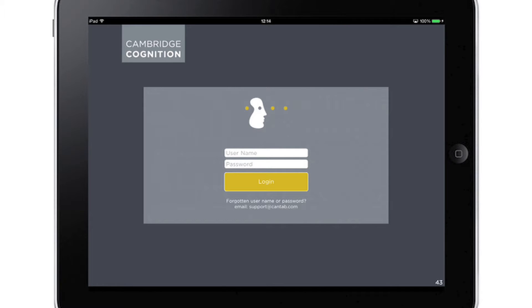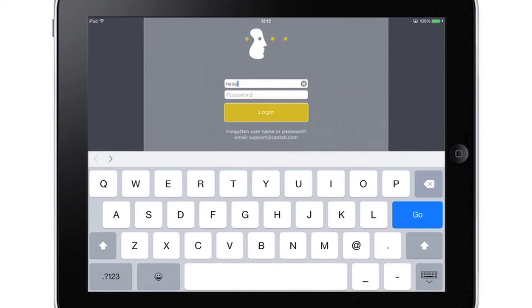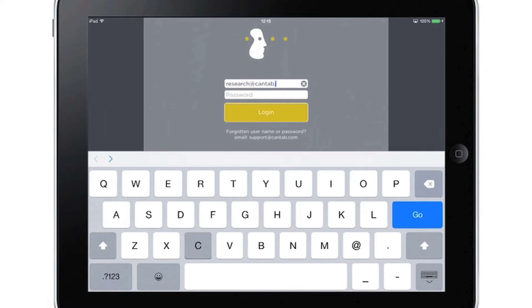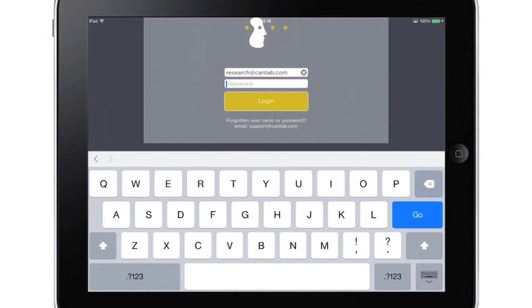Once you have followed the desktop user guide to create your study and user accounts, open Cantab Connect Research on your tablet and log in using the email address and the supplied password. After the first login, you will be asked to change your password so you can make it something memorable and secure.